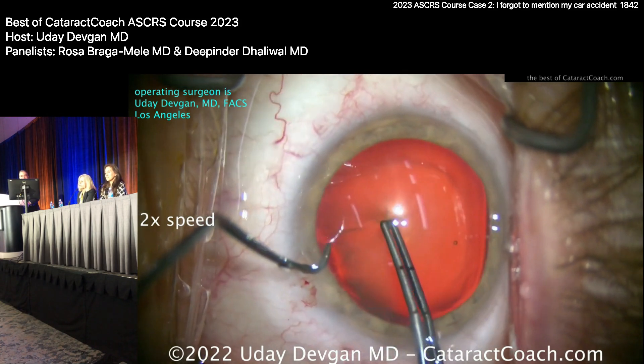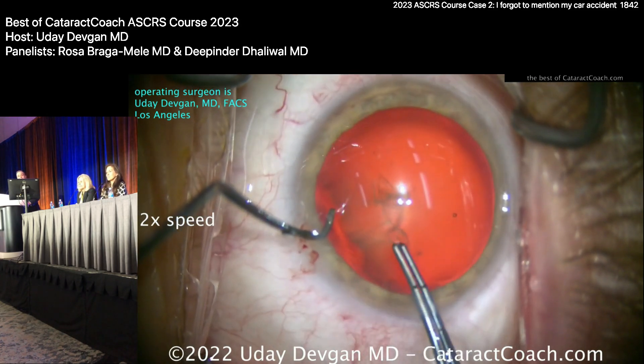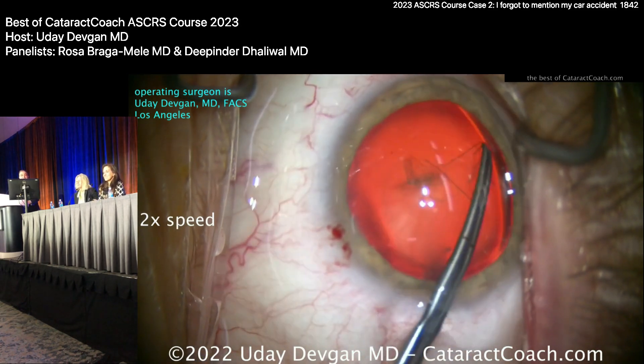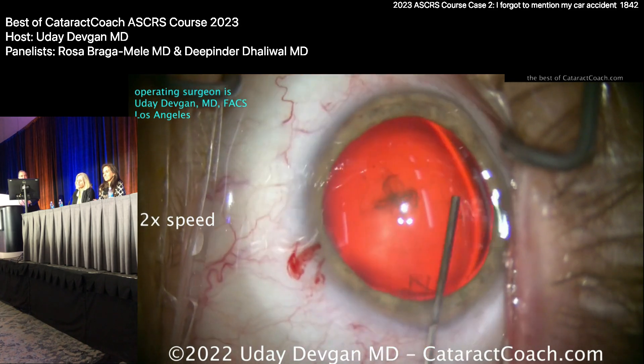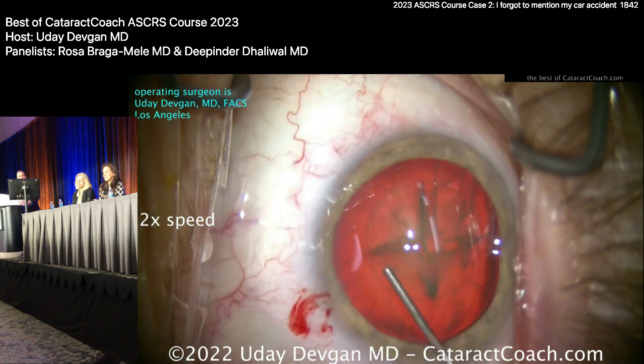Getting a nice rhexis now. As I do the rhexis, it looks pretty reasonable — not wrinkling of the cap. Maybe my forceps were just dull, that's what I'm trying to convince myself. I'll do a little hydrodissection; I want this thing out of the bag.